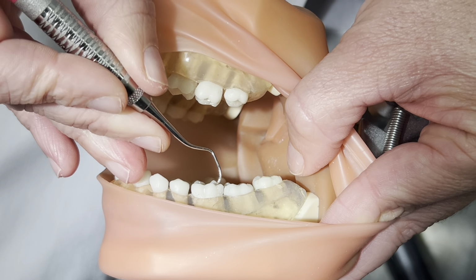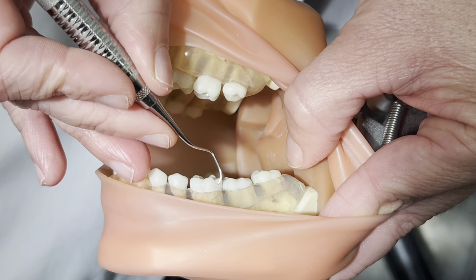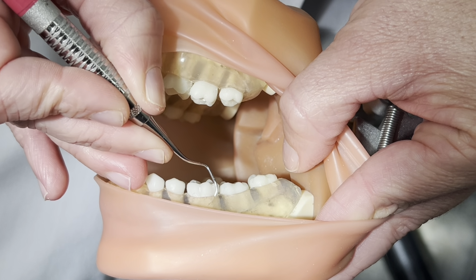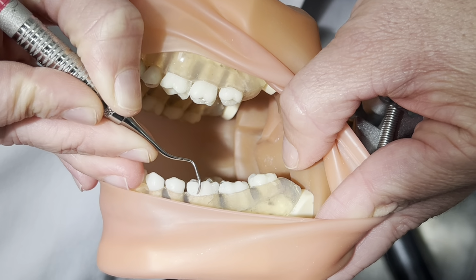Next is an oblique stroke. Those are diagonal strokes. We apply those on the straight buccal, straight lingual. So they would look like this, oblique strokes.